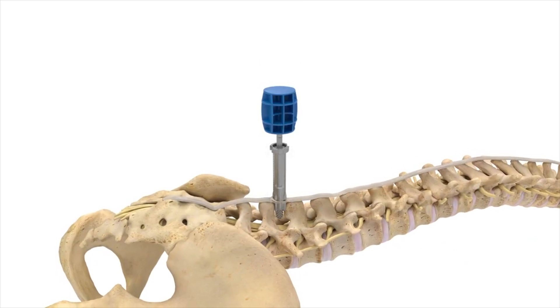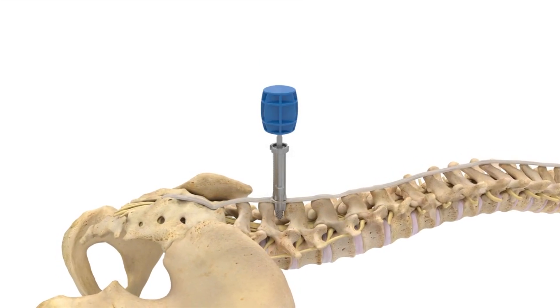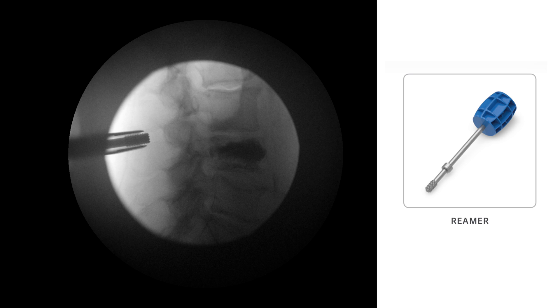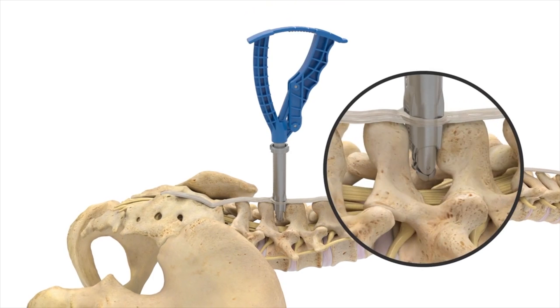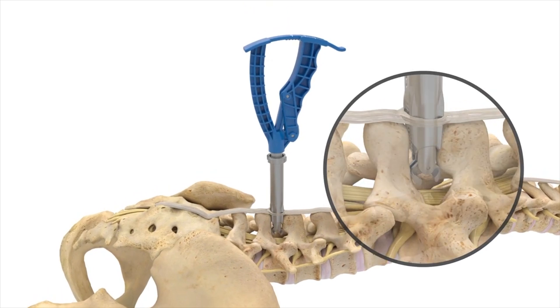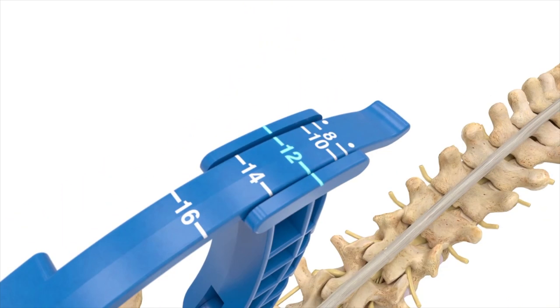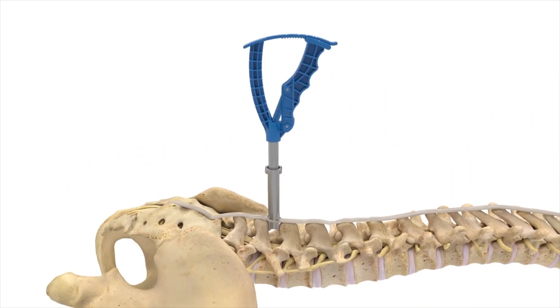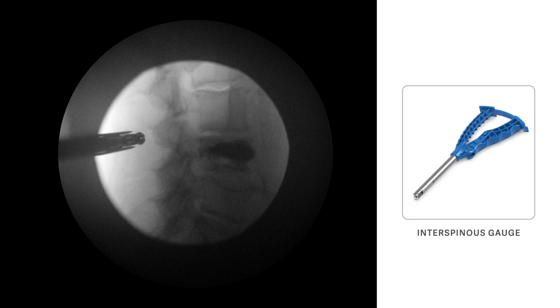Next, the interspinous space is prepared by inserting the reamer through the cannula. Care must be taken to avoid advancing the reamer past the facet shadow or spinal laminar junction. The interspinous gauge is then inserted through the cannula to determine the proper implant size. The distal tips of the gauge should contact the spinous process dorsal to the spinal laminar junction of the superior lamina.